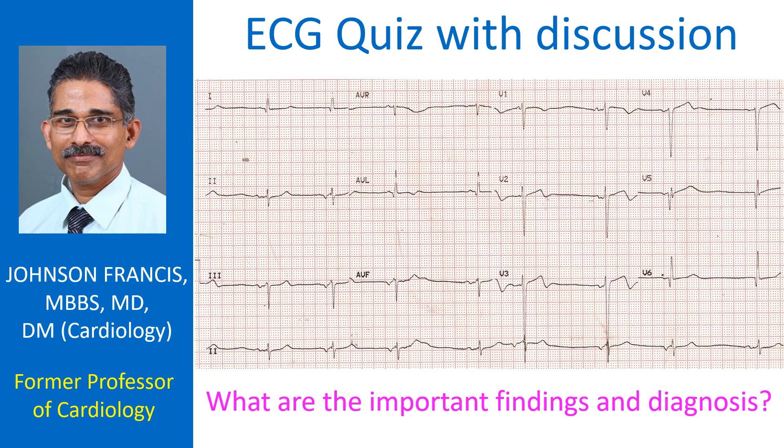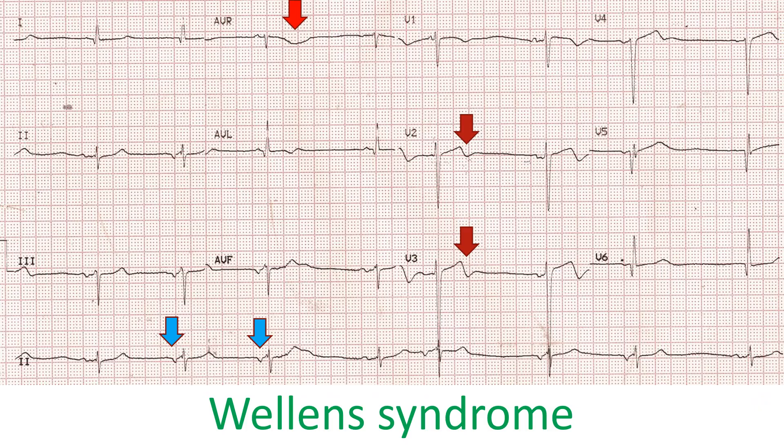What are the important findings and diagnosis? The first beat in the rhythm strip is a sinus beat, and so is the fourth beat as well as the last beat, with upright P waves and a normal PR interval.